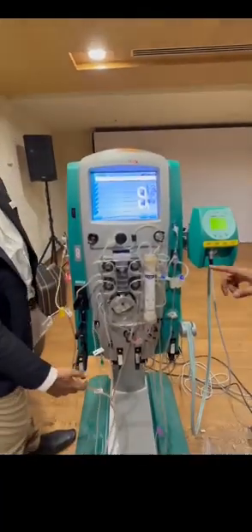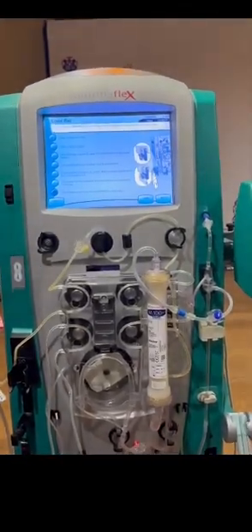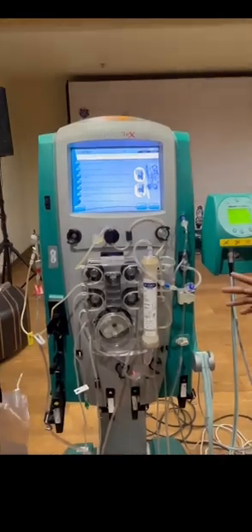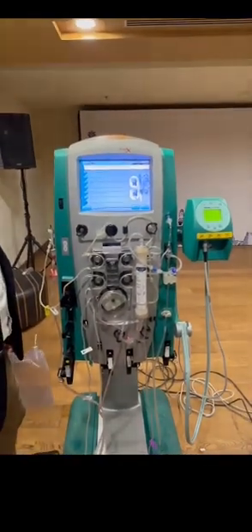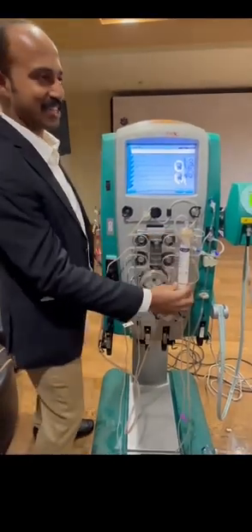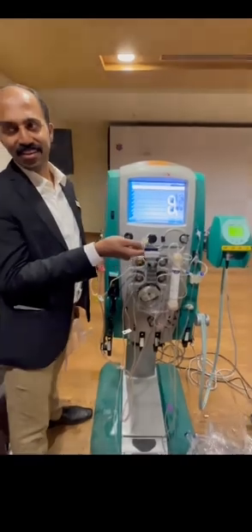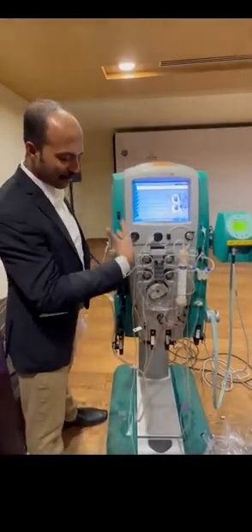So if one filter goes for, suppose, 12 to 24 hours, once the filter clots, the entire cartridge has to be removed. Yes, the entire system you have to change, throw it. In HD we have only that filter; we can just clean it and fill the disinfectant. But here, how long will you get?